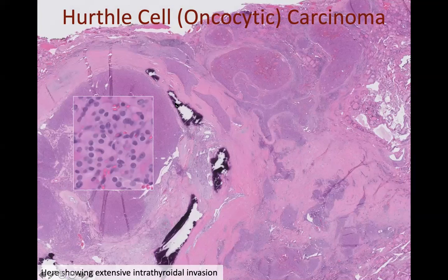Interestingly, I will point out here, in this particular case, there are these very dark purple areas in the capsule that are calcifications.